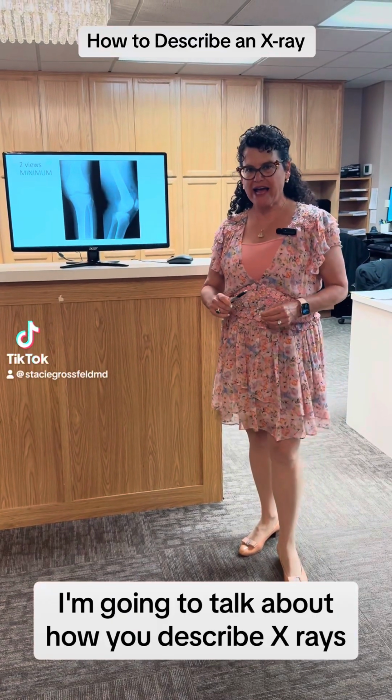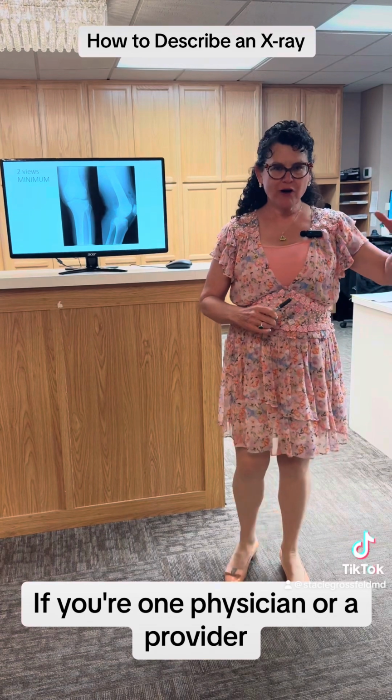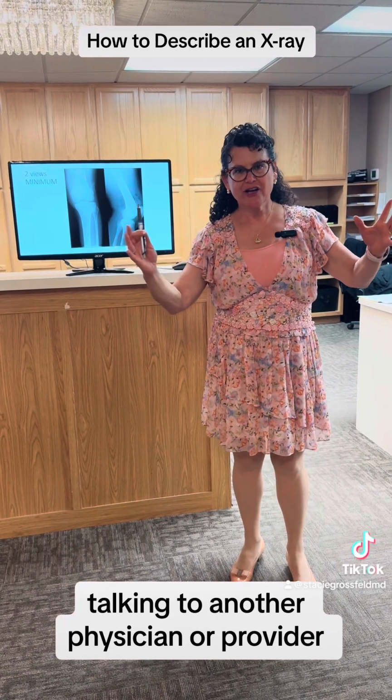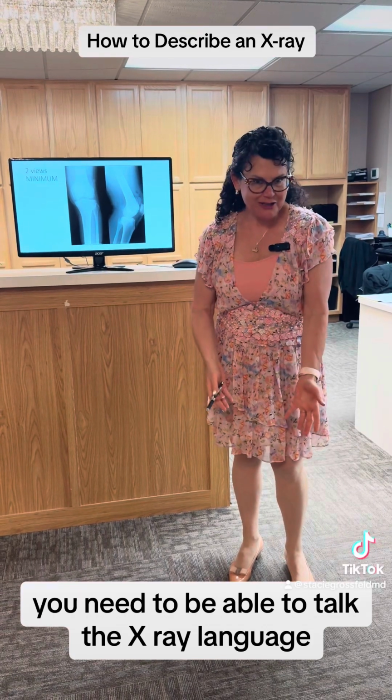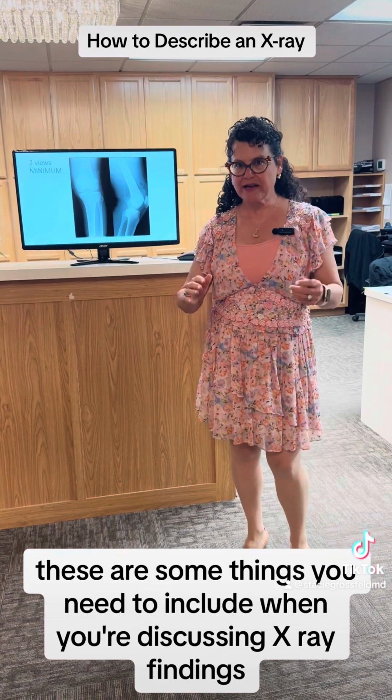I'm going to talk about how do you describe x-rays. So if you're one physician or provider talking to another physician or provider, you need to be able to talk the x-ray language. So these are some things you need to include when you're discussing x-ray findings.